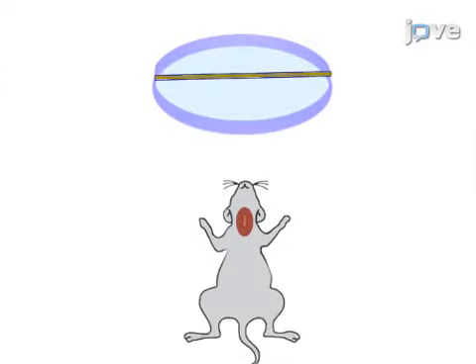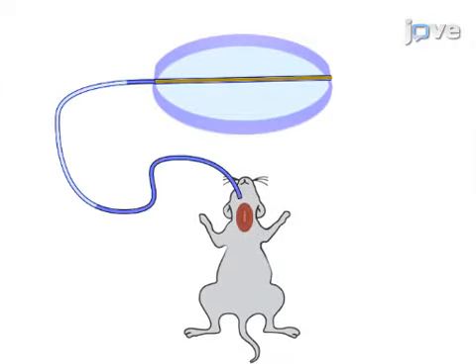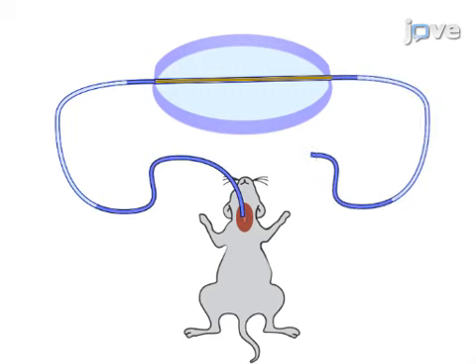In the second step, polyethylene and silicone tubing are connected to the chamber and then surgically to the mouse. Next, blood from the carotid artery is allowed to flow through the tubing, and the subsequent interactions of the native leukocytes with the coated glass chamber are recorded in real time.